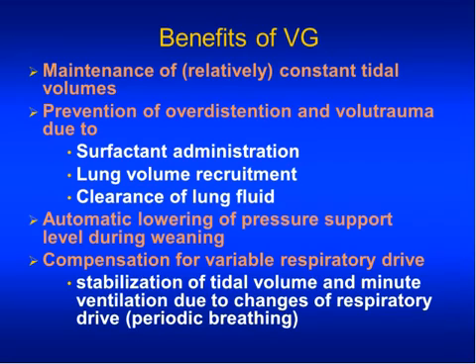In terms of the benefits of volume guarantee, they include maintenance of a relatively constant tidal volume, and it's not completely constant because the baby is always perturbing the equilibrium with their irregular respiratory effort. But that's actually a good thing, because completely monotonous tidal volumes result in atelectasis over time. So some variability, physiologic variability, is important.